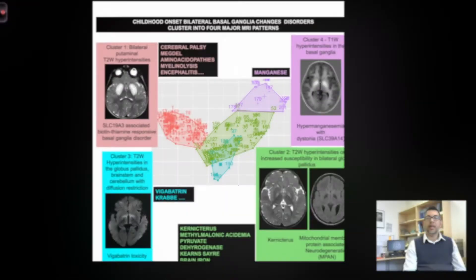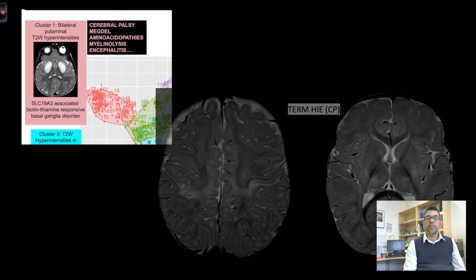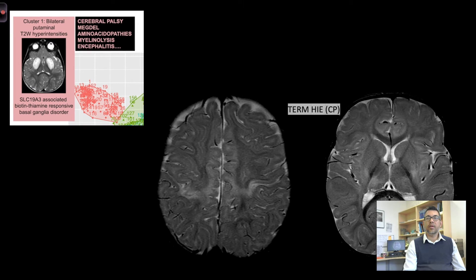The largest group consisted of children who had T2-weighted hyperintensities in the putamen, including cerebral palsy due to birth injury in term infants, but also rarer disorders like biotin-thiamine-responsive basal ganglia disease.